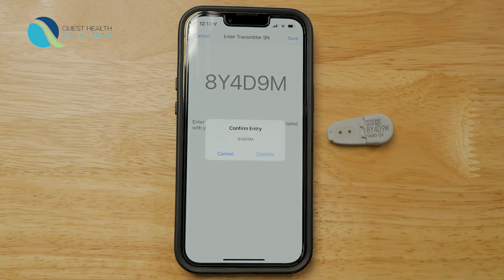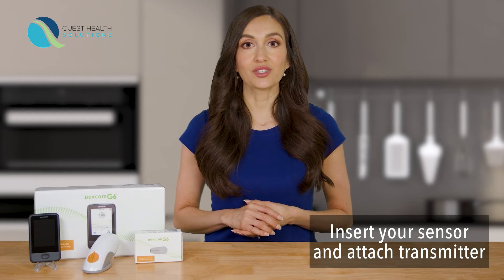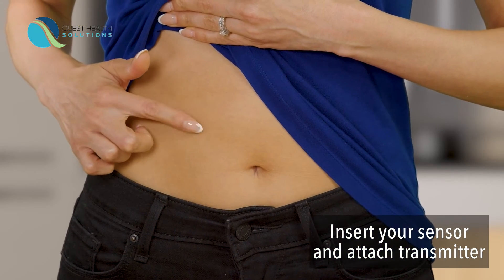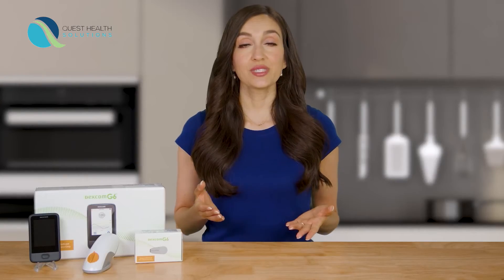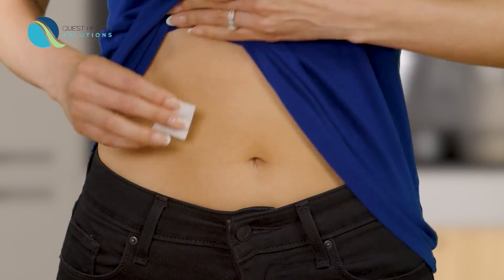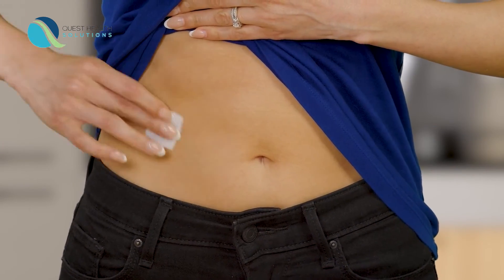That's it for app setup. Now you'll need to insert your sensor and attach your transmitter. To insert your sensor, first choose a place on your abdomen. Choose a site at least 3 inches away from your insulin pump infusion set or injection site. Next, clean your skin with rubbing alcohol and let it dry.